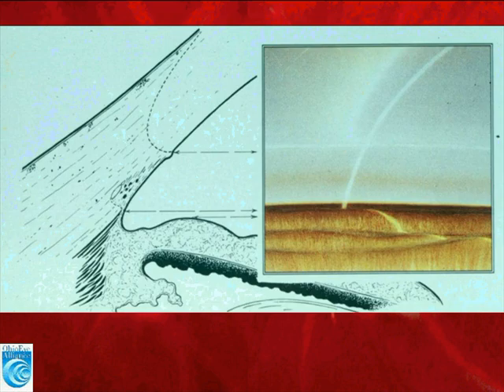How do we know that that's Schwalbe's line? Well, look in the image rightmost on the screen, and in that image you can see the wedge, and where the wedges come together of light, that is always Schwalbe's line. Here's another image where we can see trabecular meshwork a little bit more pigmented, and notice that the pigment in this case is deep, but Schwalbe's line always will follow that wedge. We can see the wedge superiorly, and this corresponds with the drawing on the left.